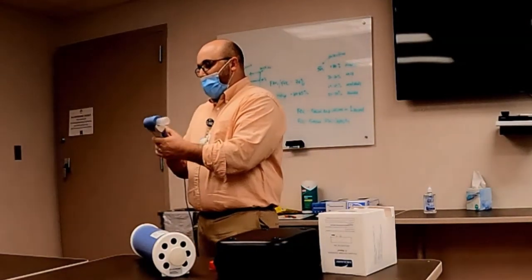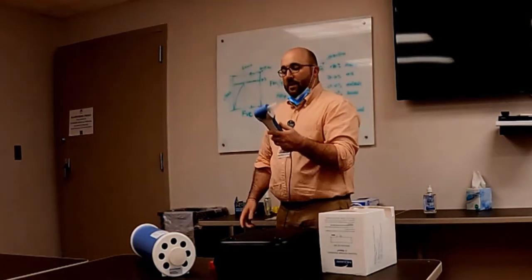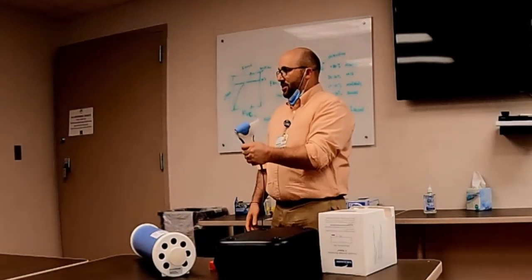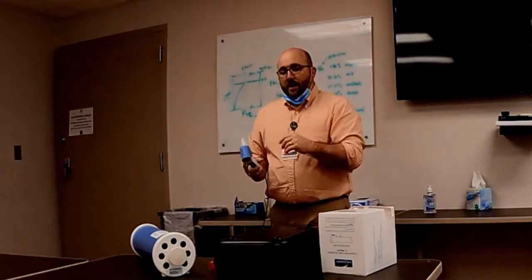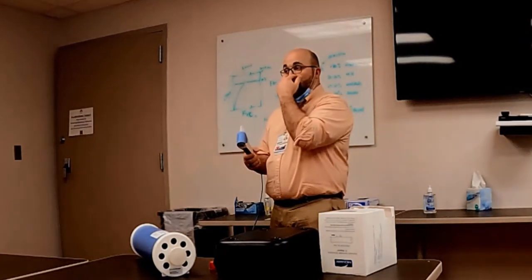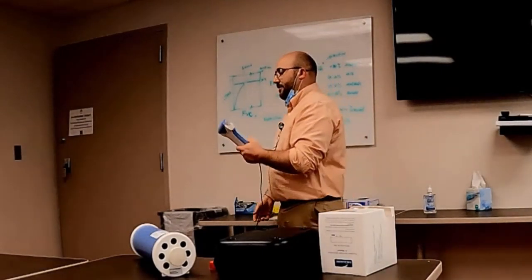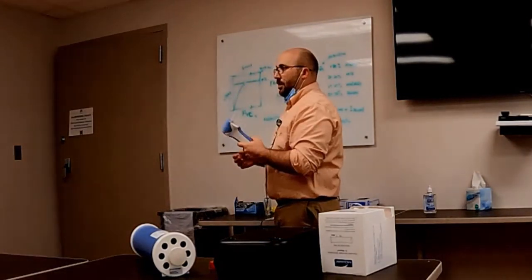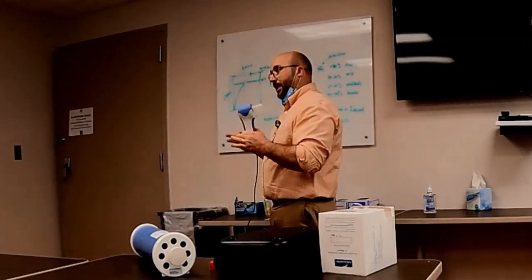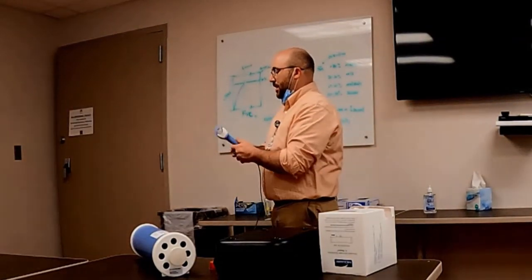So after we get that done, it's time to do the spirometry. So I always recommend that the patient holds it. And so you hand it to them, this is yours to hold while we do the spirometry, and you're the coach. So you're gonna coach them through it. A second aspect of this, what's really important, and they're gonna work on this, is getting a set of nose clips. And I'll show you when we go downstairs and do it, why you need nose clips. Because if I have them breathe on this, and they're a nose breather at all, you lose all your air. So the only way to get really, really accurate tests is to have the nose clipped. Those are usually disposable, use them just one time.